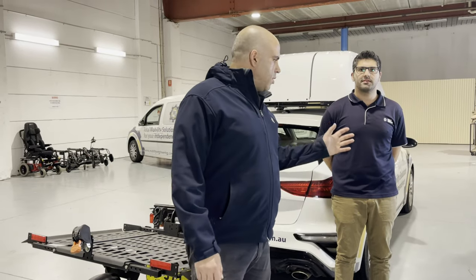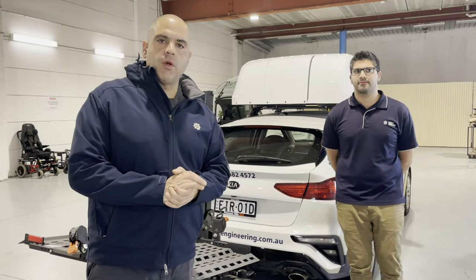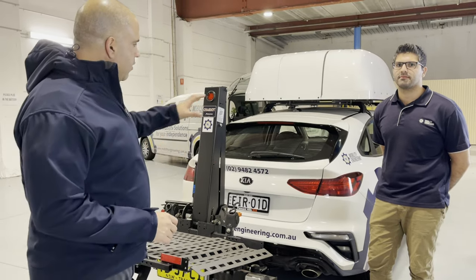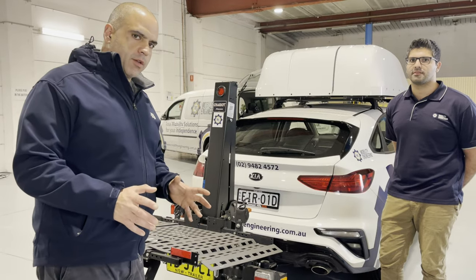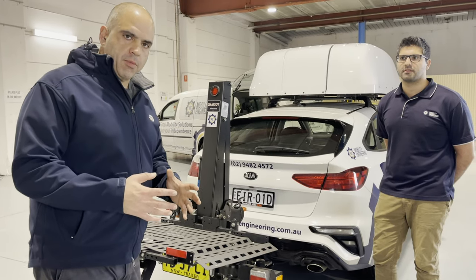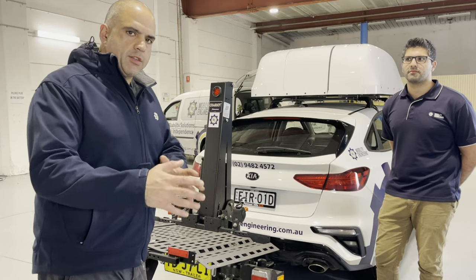Hi everybody, this is Ali Ekbarian here with Amin from Mobility Engineering. We're here in front of the Chariot trailer, which is a product that we distribute in Australia from Bruneau Independent Living Aids in the US. The Chariot is quite a popular product in Australia because you can carry scooters and power wheelchairs on it whilst having a very small vehicle towing it along behind you — very versatile, very popular, and a great product. Today we're going to run through a few steps on how to remove the product from your vehicle, because it can come across as a little complicated, but it's not as long as you follow the certain steps.